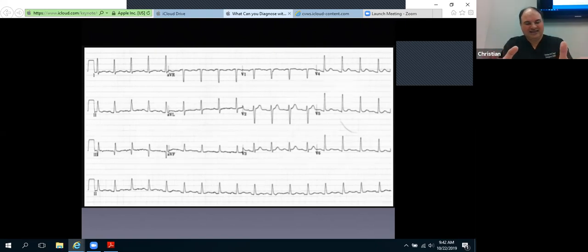It's to take each one of these leads and, in your mind, rotate them all around to truly understand what's happening with the movements of that heart. And the reason it's so abstract is that it's given to you in an anti-intuitive way.